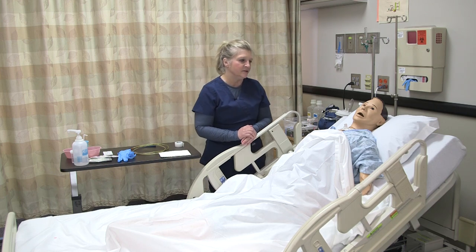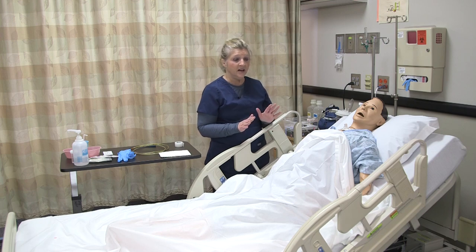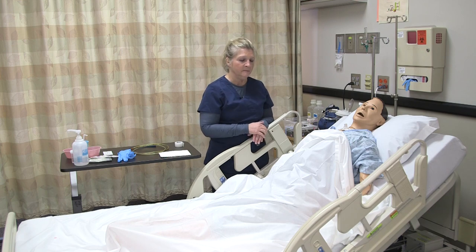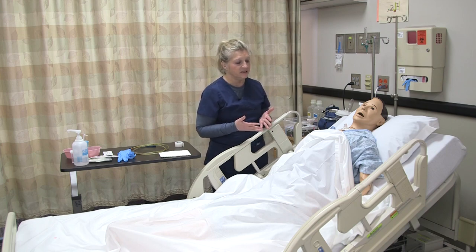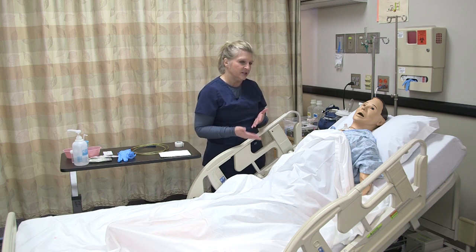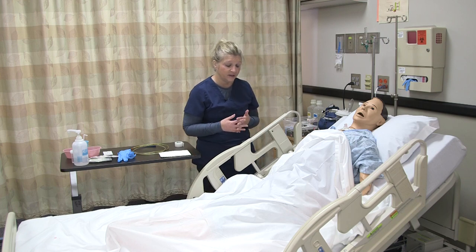Make sure the patient and you decide on a signal if they need you to stop or if something isn't right. You can have the patient and you agree that if the patient needs you to stop, maybe put their hand up; if everything's okay, thumbs up. We've determined why the patient needs this and confirmed in our assessment that the patient doesn't have any contraindications to performing this. Also, when I verified the patient's identification, I also wanted to make sure to verify allergies.